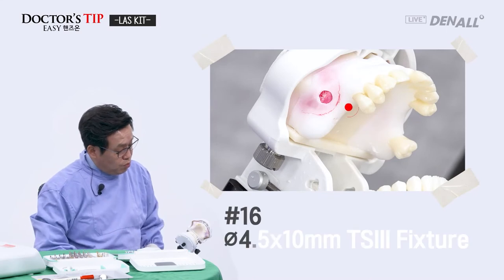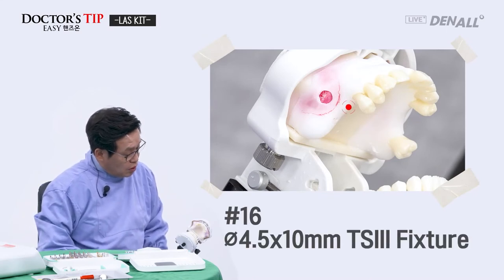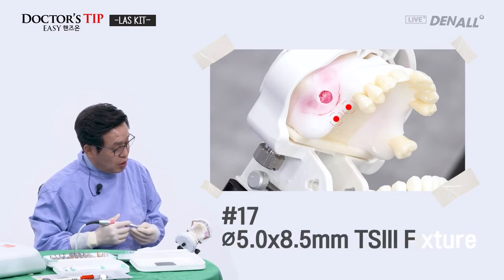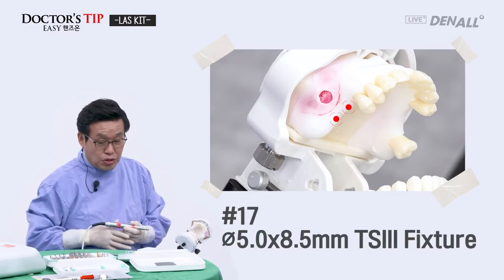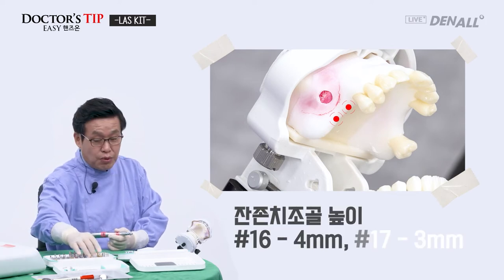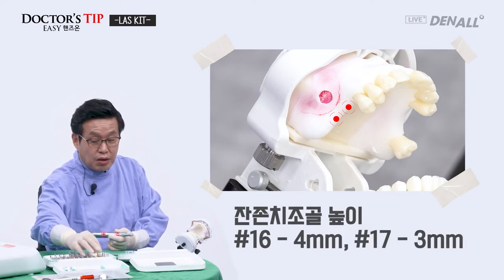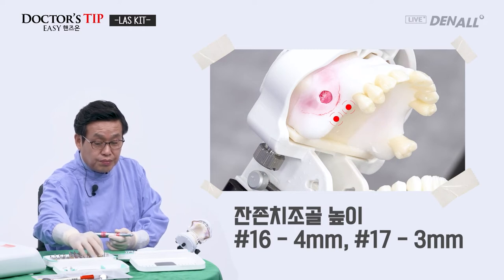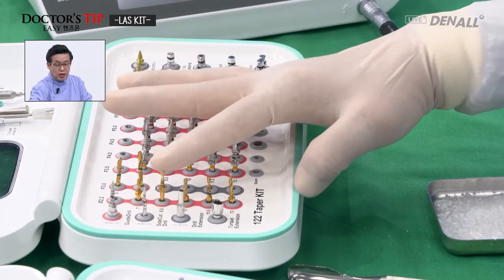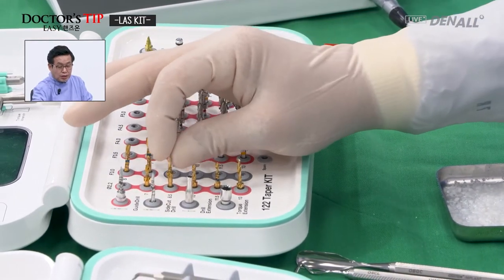And number 16, TS3, 4.5, 10 millimeter, and number 17, 5.0, 8.5 millimeter fixture will be placed. So the bone remaining is 4 and 3 millimeters. So for the drill, I will just use 8.5. So first, with the straight drill, I will expand the hole first.